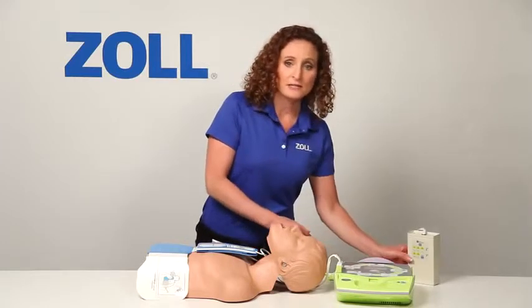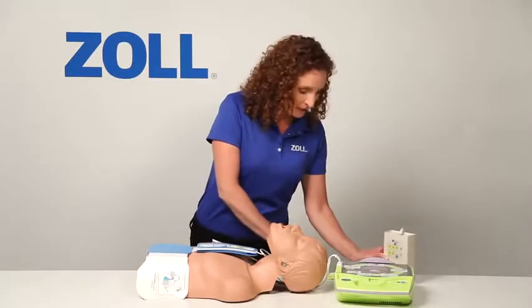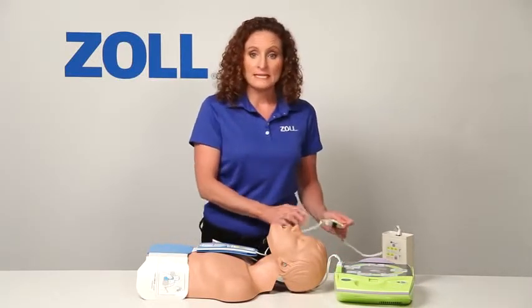I will set the simulator to present asystole, an unshockable rhythm. When I plug it in, the AED Plus recognizes the presence of a heart rhythm and begins analyzing it.